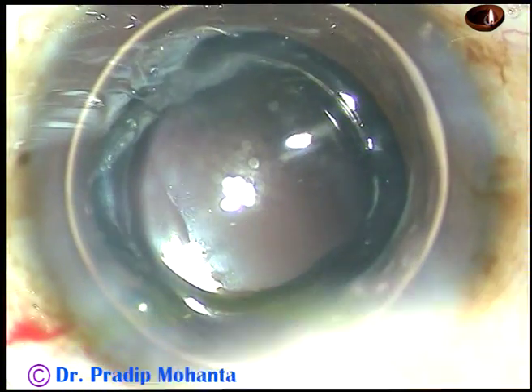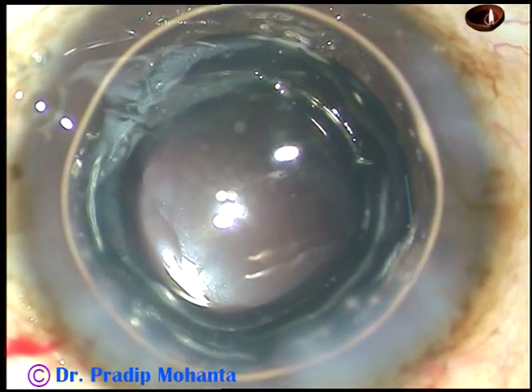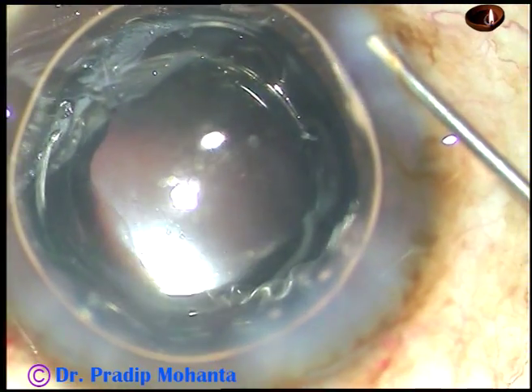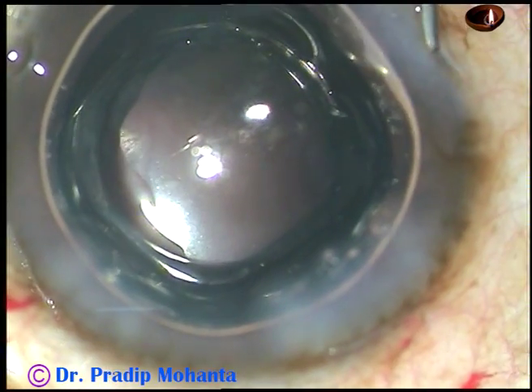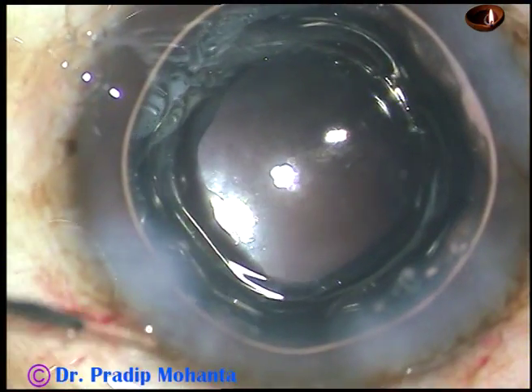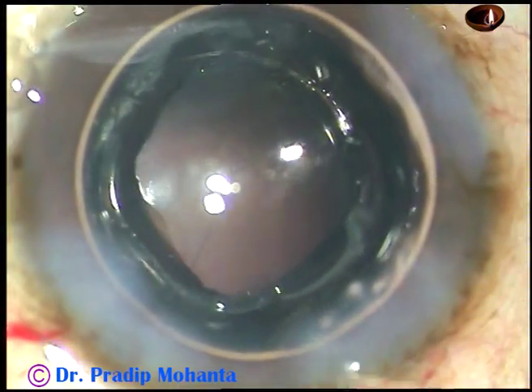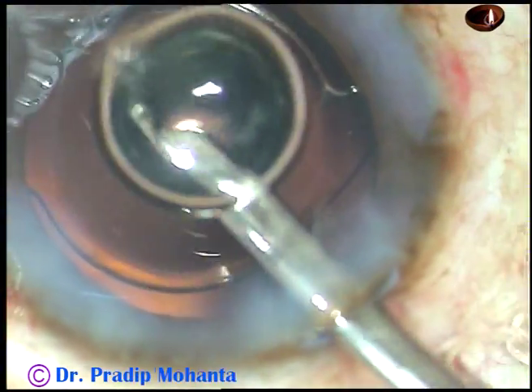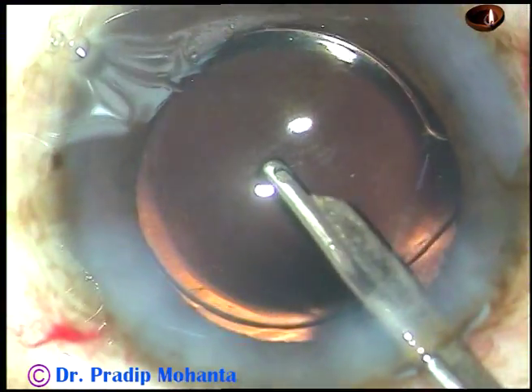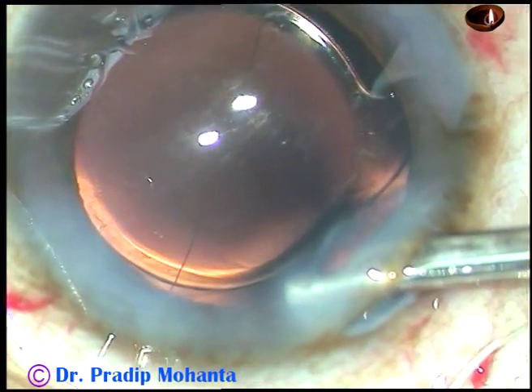Since the anterior chamber was becoming shallow, I have injected a big bubble of air. A bit of moxifloxacin has been injected. Now this is hydro-suture — hydrate the stroma on either side of the stab incisions so that the stab wounds close. Take the 23 gauge Simcoe with some fresh BSS in the syringe, irrigate and then aspirate, place it at the wound, form the anterior chamber, and then conclude the case.